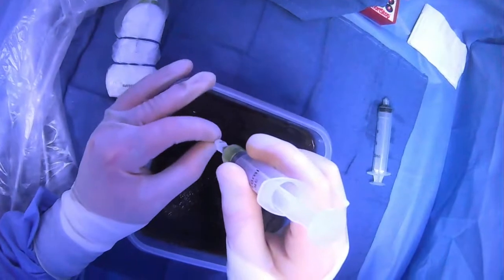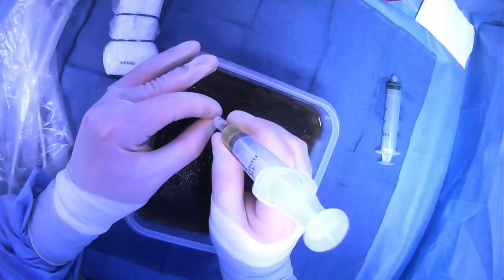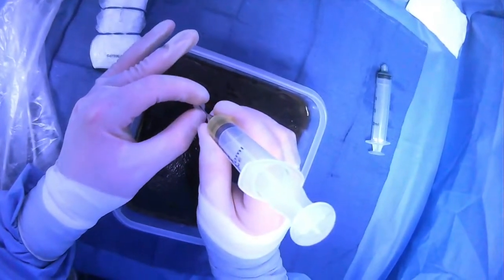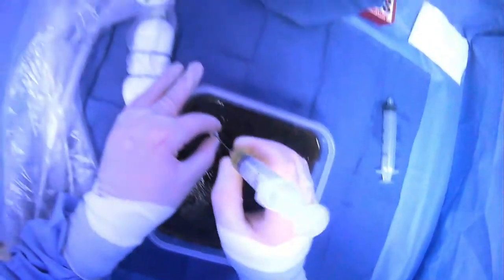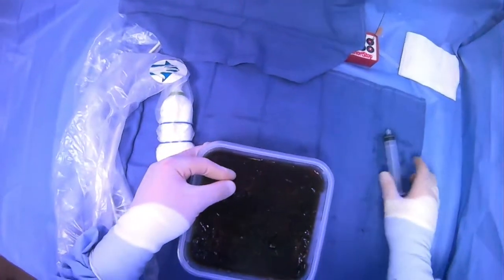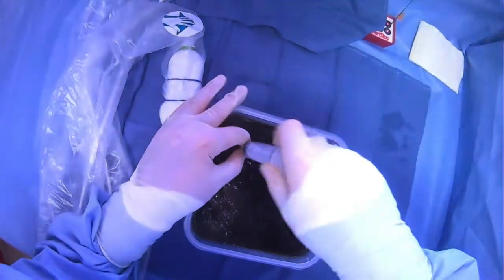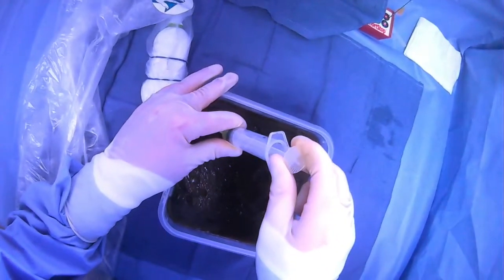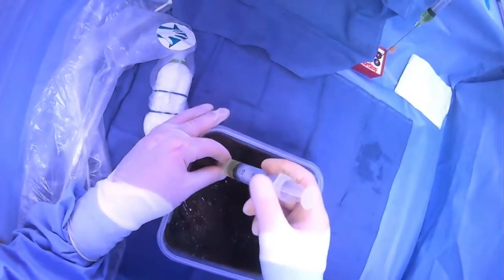What we're going to do is keep our hand very, very steady and just feed off the catheter. We're not moving the needle — the catheter is the only thing going forward. Once we've hubbed the catheter, we take the needle out, bury our sharps, and then hook up to our syringe so we can pull back ascites and take whatever we need to send for analysis.